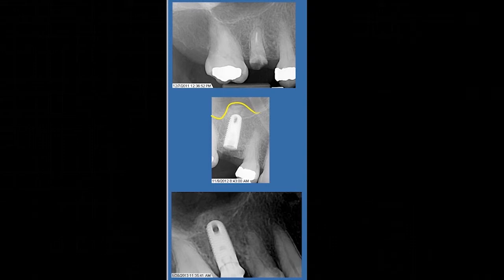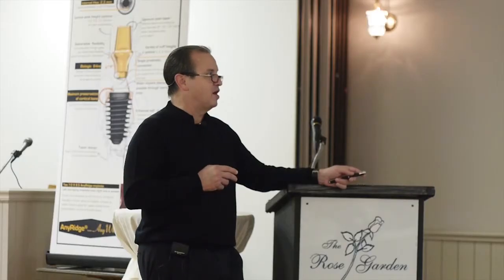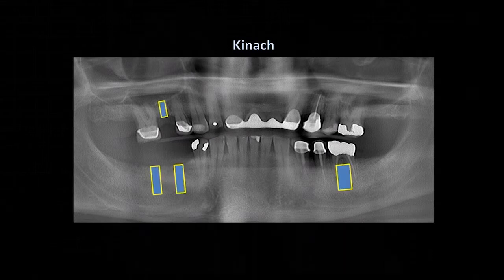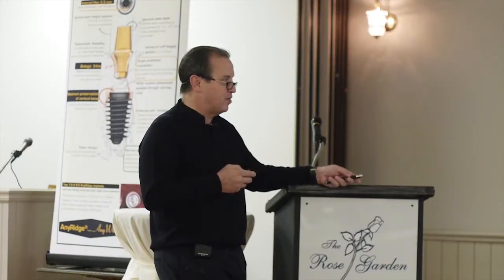So this is a case that could be done concomitantly with grafting, or perhaps in some cases the graft is done ahead of time. In this case, we grafted first, went back, and Dr. Domang placed the implant after. Some of these cases are from the course that we give in the office that I'll talk about later. But it's just showing a patient graphically what we're thinking about doing, how much bone's available.